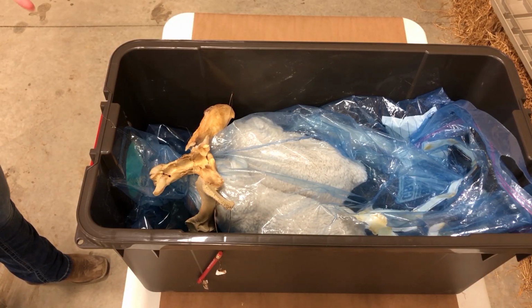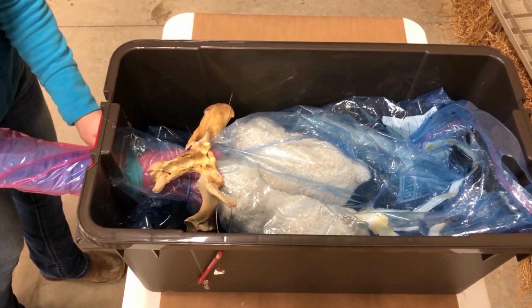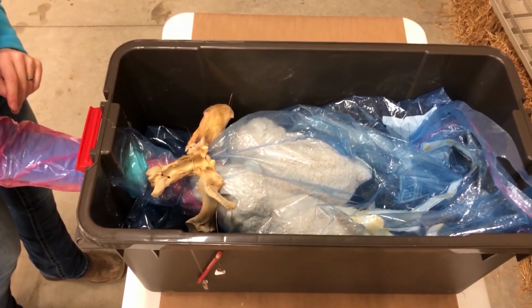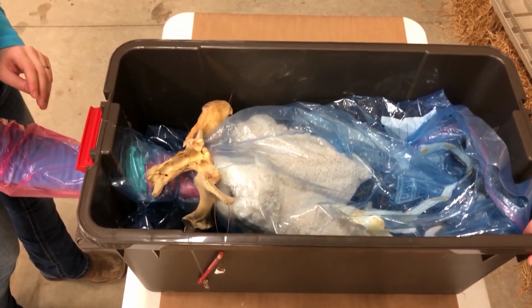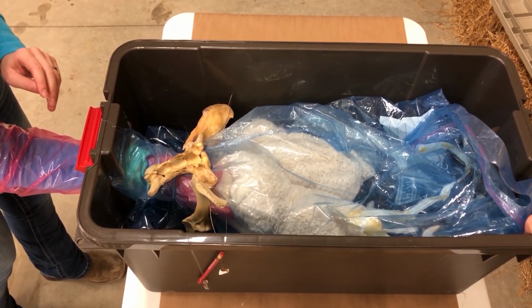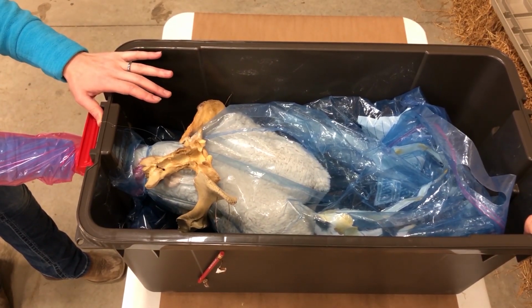So when we talk about twins with tangled legs, it's actually going to feel like a normal presentation, right? So I've got one head here, and I've got 2 legs. If you can see through there, I've got 2 legs. It feels like a normal presentation. 1 head, 2 legs. I go to pull and I have some resistance.